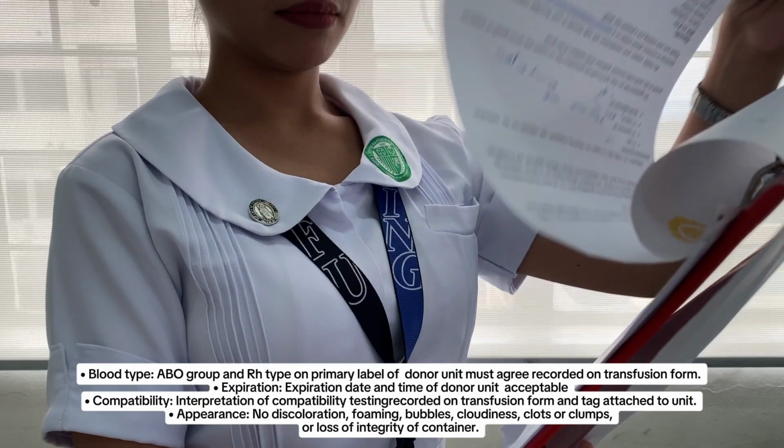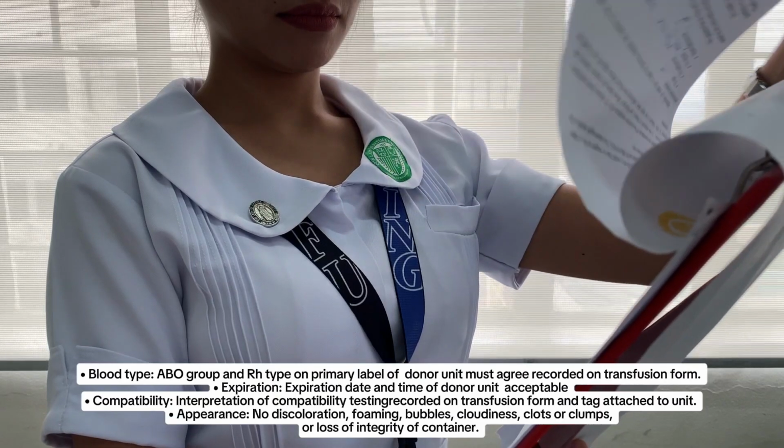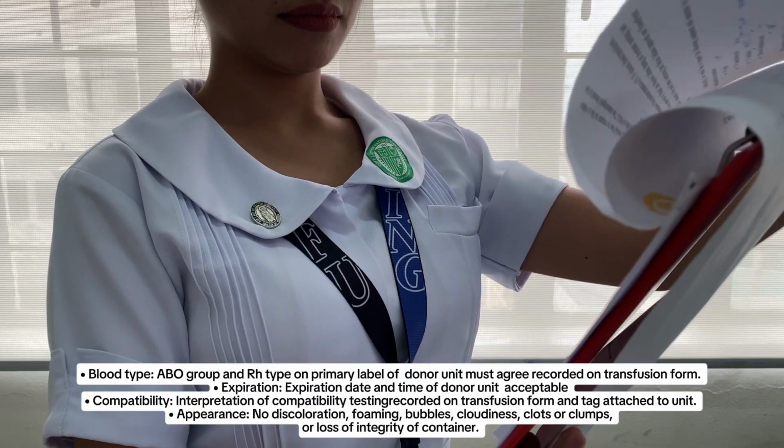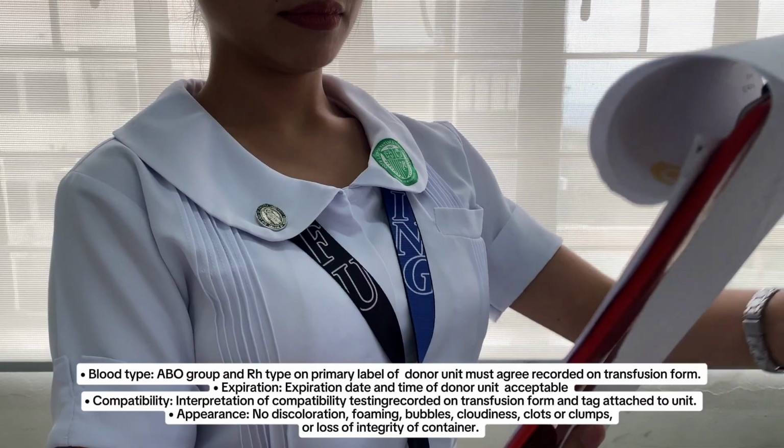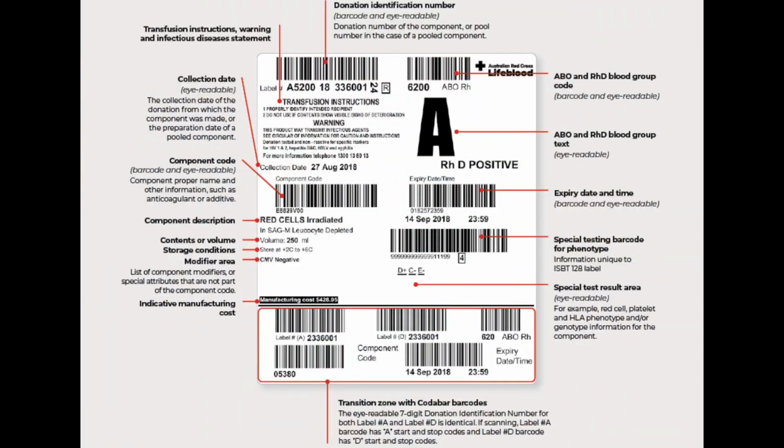There should be no discoloration, foaming, bubbles, cloudiness, clots, or clumps, or loss of integrity of the container. These are the pieces of information that should be attached to the blood bag.